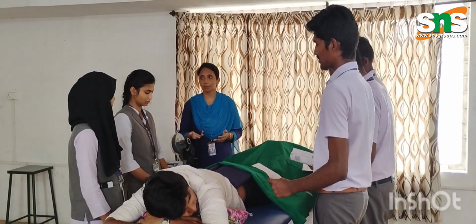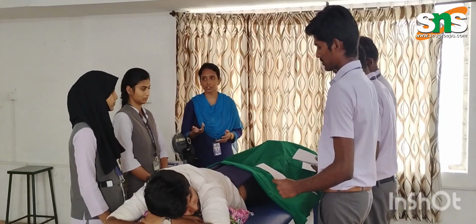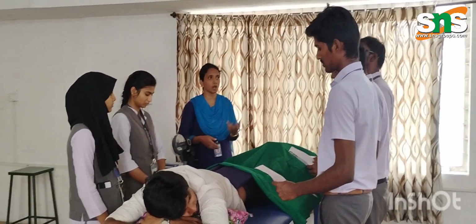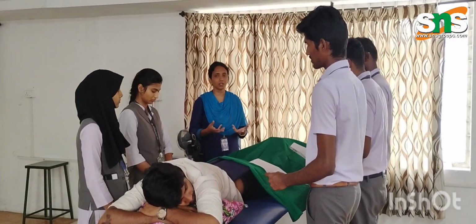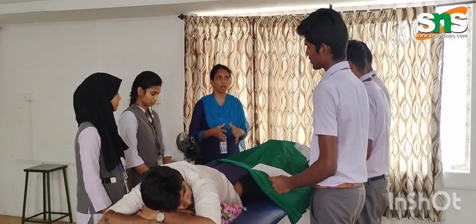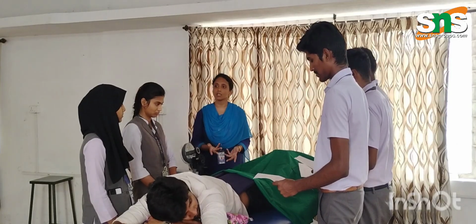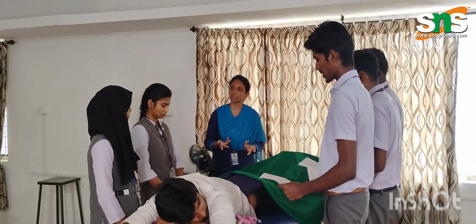So let us hear from our mentees about the introduction of the case, how they are going to give the dosage of the treatment and how it is going to work out, what contraindications they need to check, and how we can integrate this in our rehabilitation protocol. So what is the case, and tell me something about it.